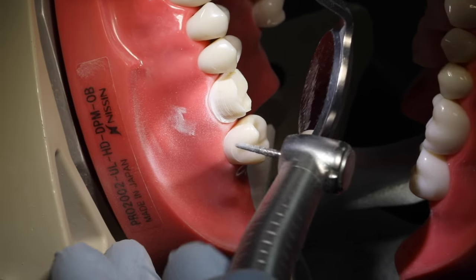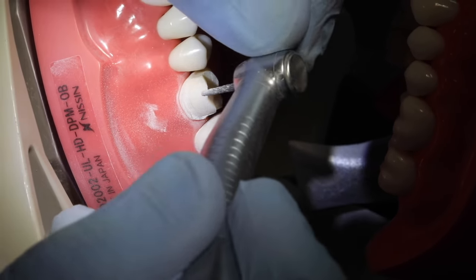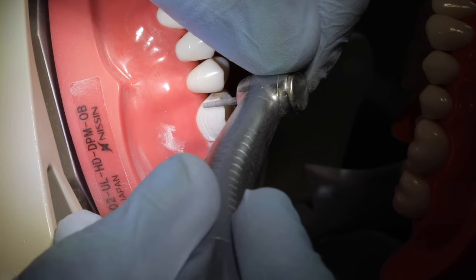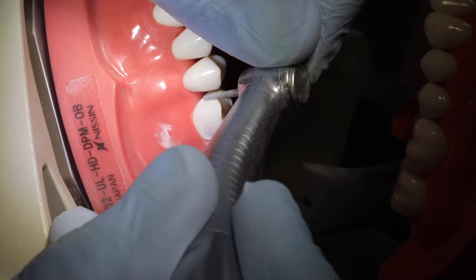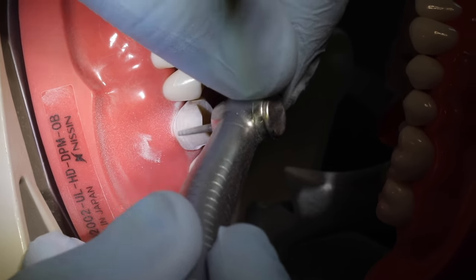Okay, we're a little bit shallow toward the line angles, the mesial and the distal line angles. The straight buccal depth is about right. The way we can measure that is just the tip of this diamond. You want this diamond to sit fully on the table of the margin, or on that shoulder.